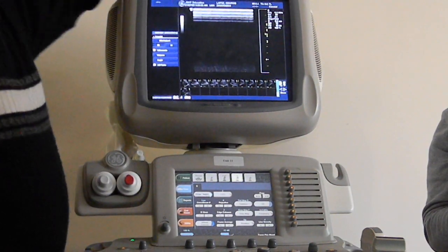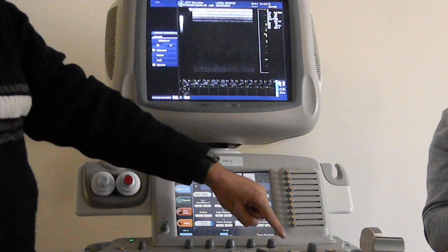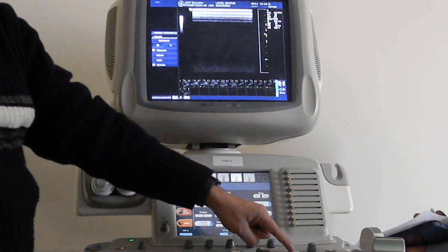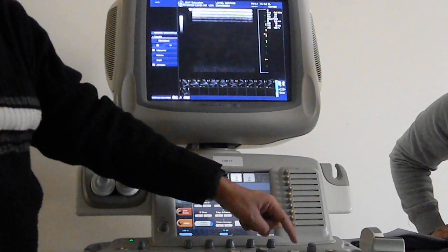Okay, so now we can talk color flow, or color doppler as we may call it. So this is going to be this one here. But right now it's off because it is yellow. So yellow light means don't go.